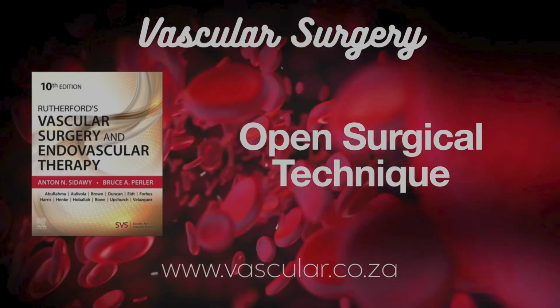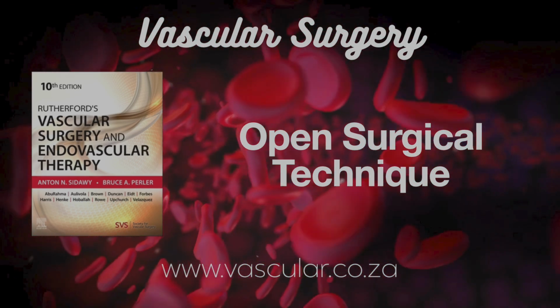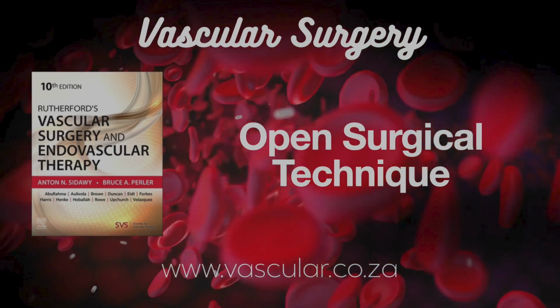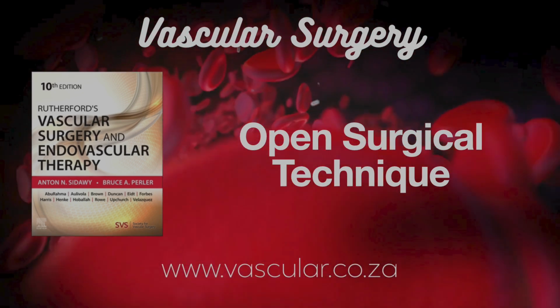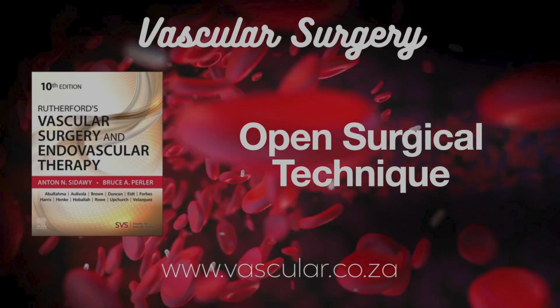Less bulky. And pneumatic tourniquets, like for knee surgery. They have a role in vascular surgery too, especially for extremity work, like bypasses below the knee and for popliteal reconstructions. What's the advantage there? Minimal exposure, dissection, and handling of the arteries themselves might reduce spasm or injury risk to those small tibial vessels.